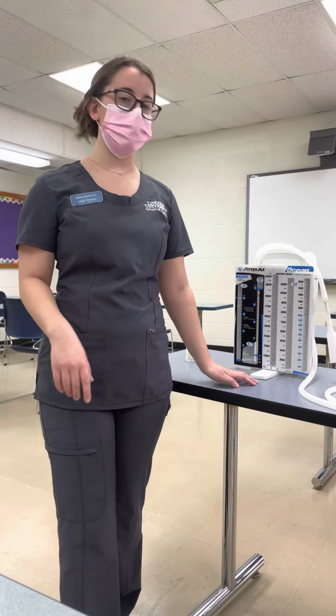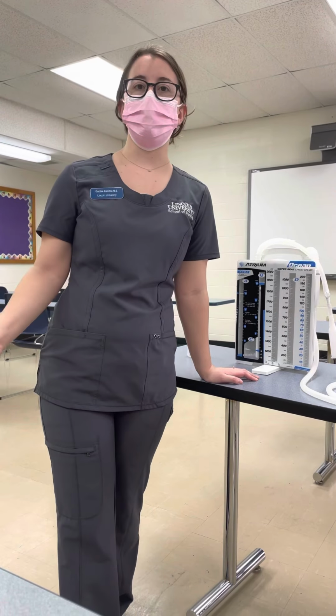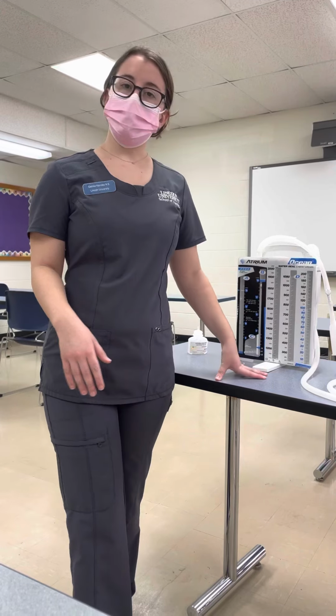The first thing I'll do is introduce myself to the patient, get name and date of birth for my patient, provide for privacy, and perform hand hygiene. Next thing I'll do is explain the procedure.